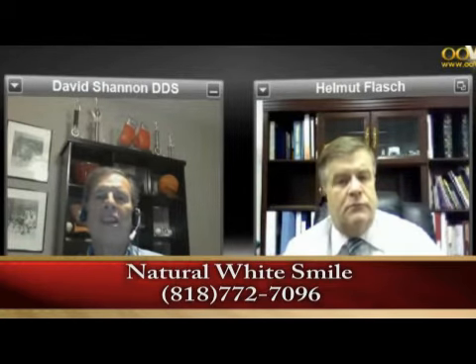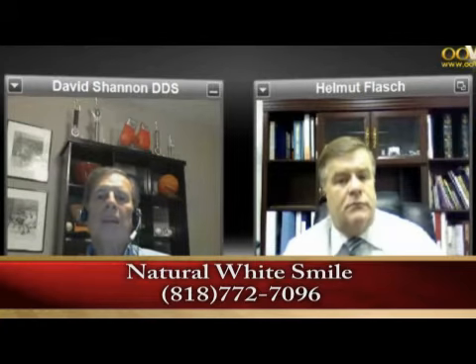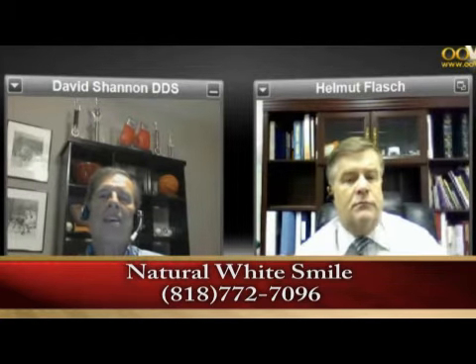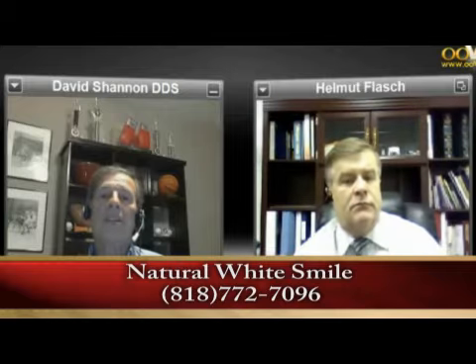Again, instant gratification. Person's wearing a denture for 20 years. What does their bone look like? Can that bone support 8 or 10 implants, and that same day that you put the implant in, put all those teeth in, cement them in, and tell them they can go home and eat? There are places that are doing that, and they're saying that it's successful, it's working. So unless I see anything contrary to that, I have to think that that's the next generation, and that's the cutting edge for that. I guess time will tell with it.